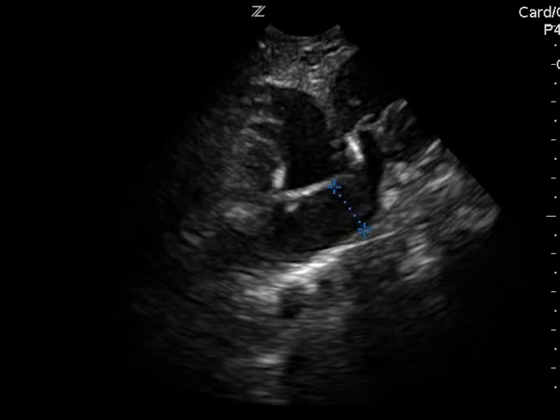If it does not collapse, I think you're still in a gray area, because that could be from a pericardial effusion, it could be from a PE, it could be from RV failure. There's a lot that can cause a non-collapsing IVC, which is why I'm trying to push people to do both an echo and IVC at the same time.